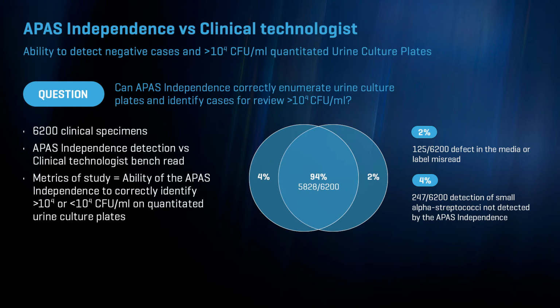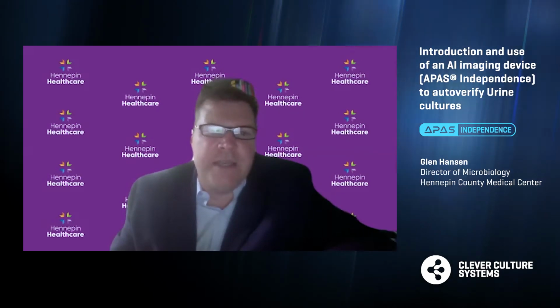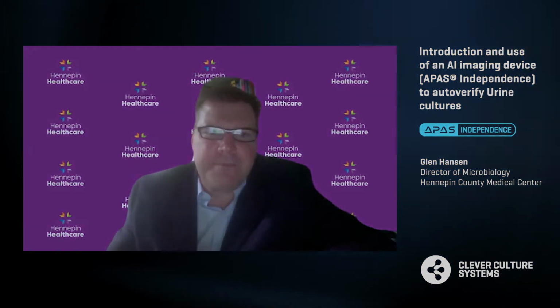Importantly, these small alpha streptococci are very rarely clinically significant. So removing those cases provided us with what we call an adjusted percent agreement of 98%, with the remaining 2% really due to variables that are out of the control of the APAS, such as defects in the media of gouges and scratches. So let's review these 4% of cases.